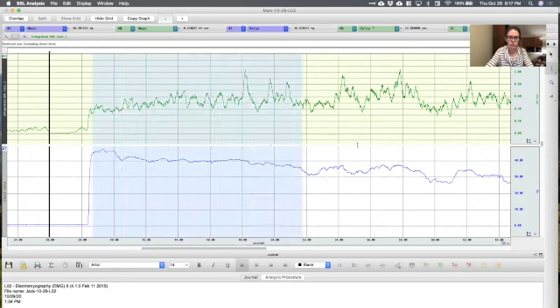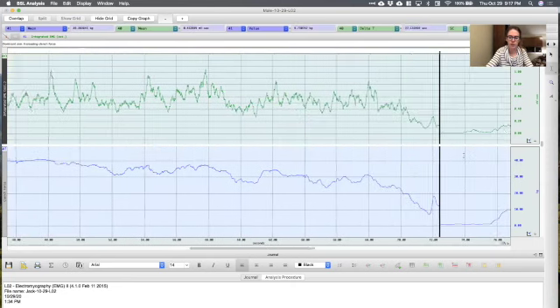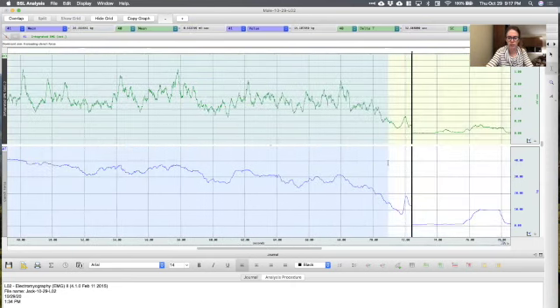And then when you get to the portion where you're going to analyze the fatigue and how long it took them to fatigue, you're going to highlight the entire thing until they obviously started to release their grip. And then you are going to use this delta T value. So it'll be in seconds alone. That's just going to be how many total seconds were they able to hang on to the hand grip until they hit that 50% fatigue level.